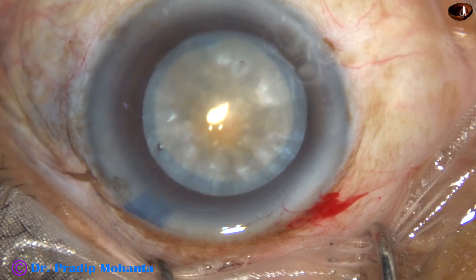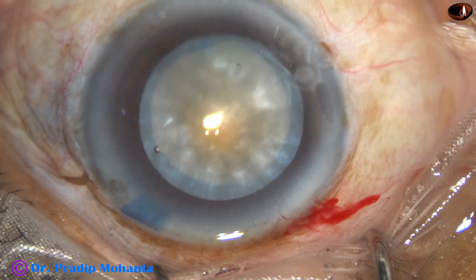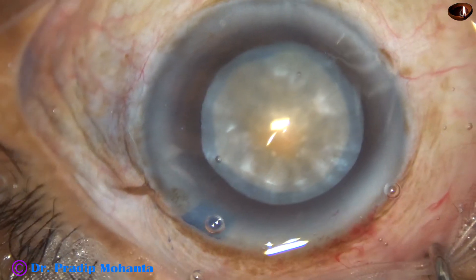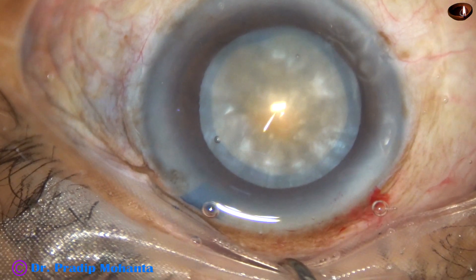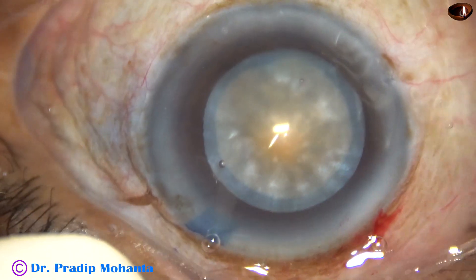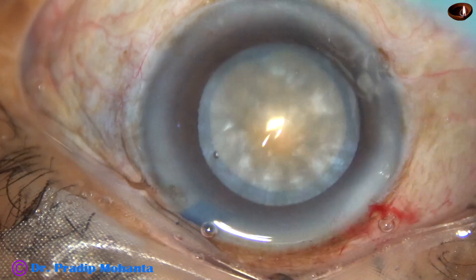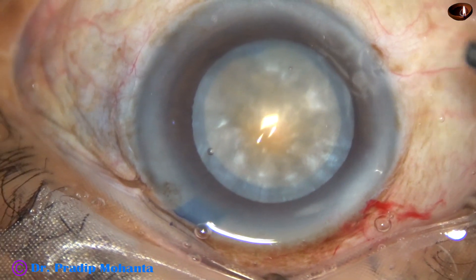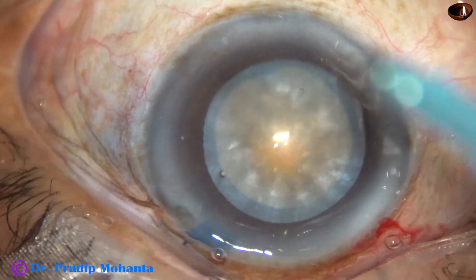If we can master this technique, we don't need a femtolaser to do rhexis in intumescent cataracts. Yes, if you have a lot of money you can buy a costly instrument, but many of us will not be able to afford that. So we have to increase our skills to a certain level.